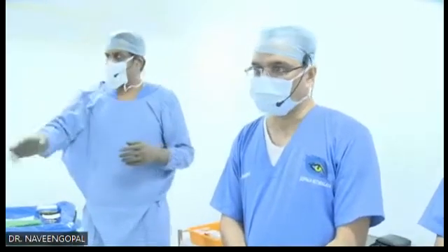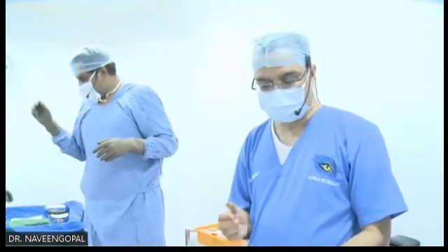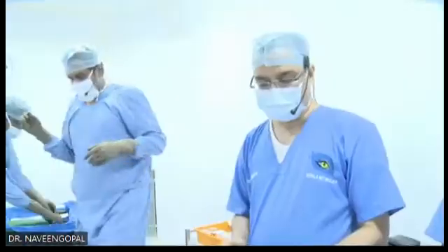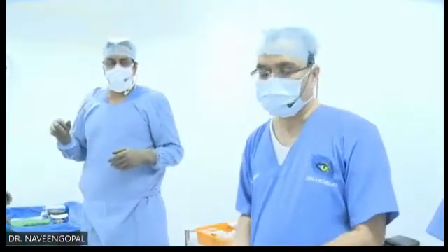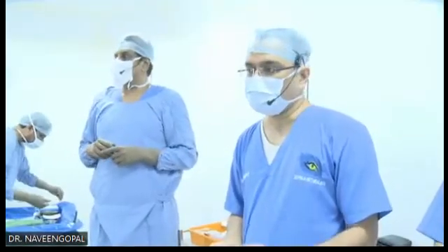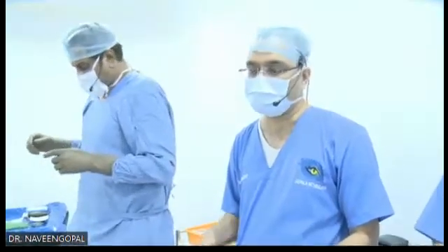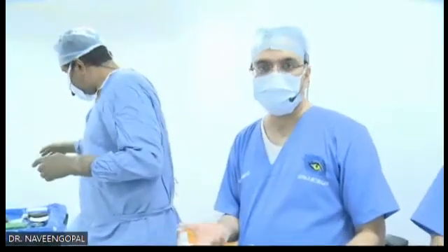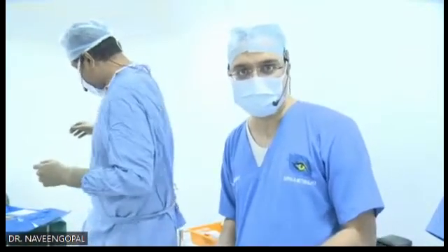So today we are going to go live on Phakic IOL, that is eye acrylic phakic IOL, where we are going to show step by step what precautions we take and what steps we do during the procedure. Moreover, it should be a discussion where we want to give practical tips for those people who have joined here. So let us start the surgery now.